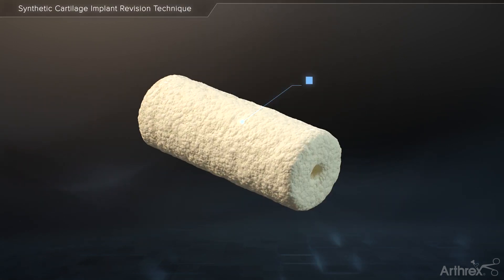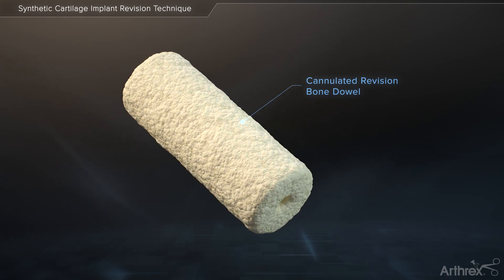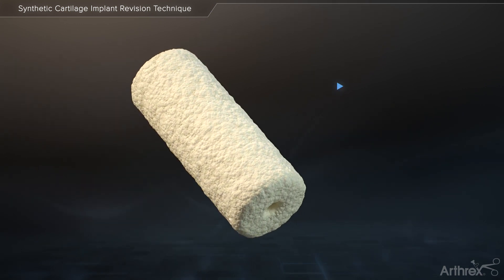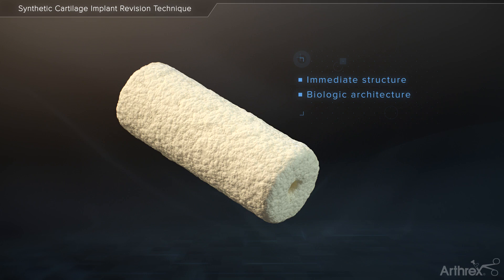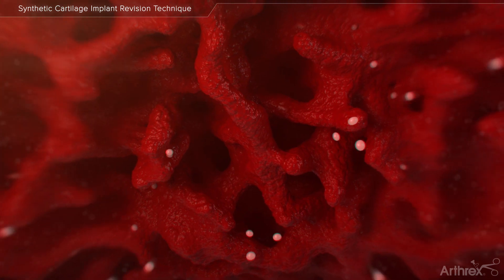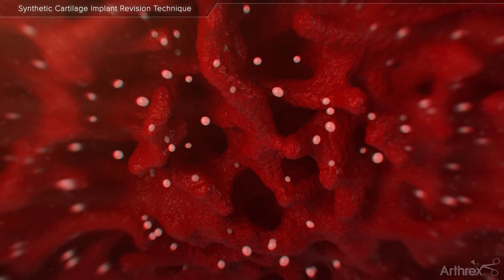The Arthrex cannulated revision bone dowels offer surgeons a quick and effective solution for filling the bone void left in the metatarsal head following the removal of a Carteva implant. The cannulated bone dowels provide immediate structure and biologic architecture for stability and incorporation. Soaking the graft in biologic fluids prior to implantation allows for an infusion of growth factors and cells to assist with the integration of the bone graft.